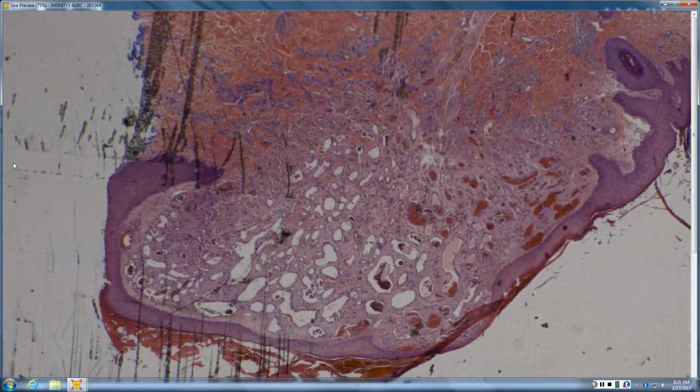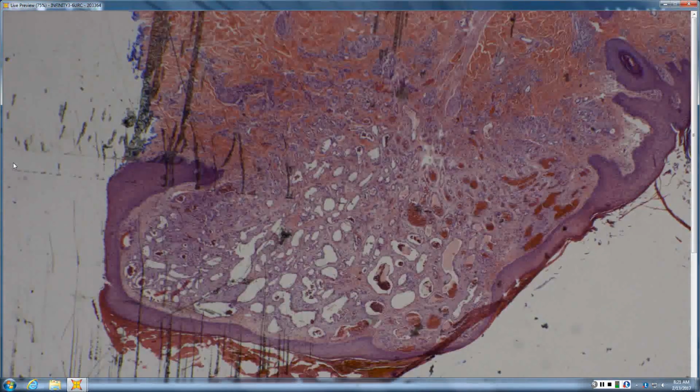Because if there were truly wedge-shaped scars that were smaller and more superficial, then you'd think of things like LPP or folliculitis decalvans, whereas this was a bigger wedge-shaped lesion. In general, benign lesions, be they lymphoid or melanocytic, the point of the triangle is at the bottom. And malignant ones, the point of the lesion is often at the top. So that's what we say, bottom heavy or top heavy. It means where is the big flat part of the triangle?